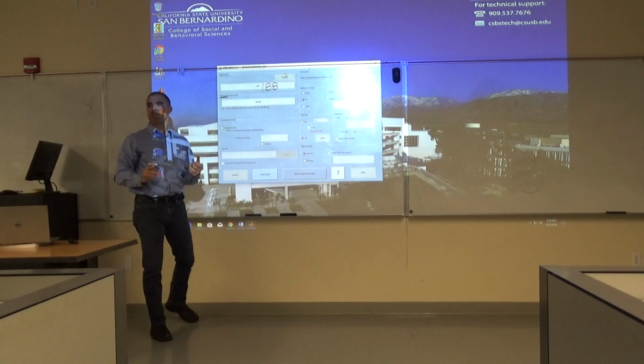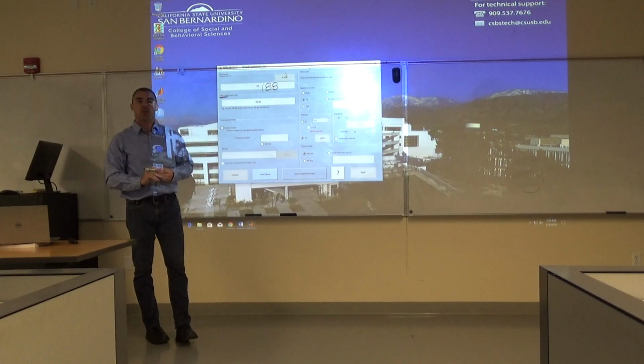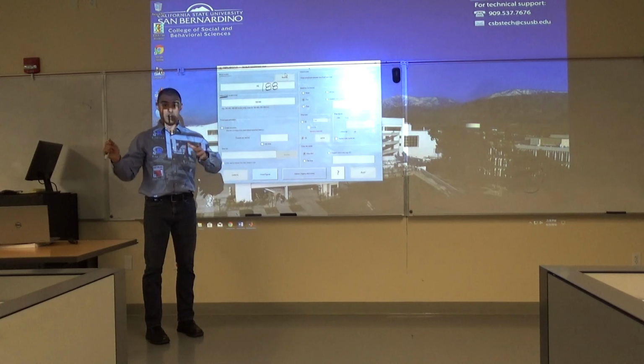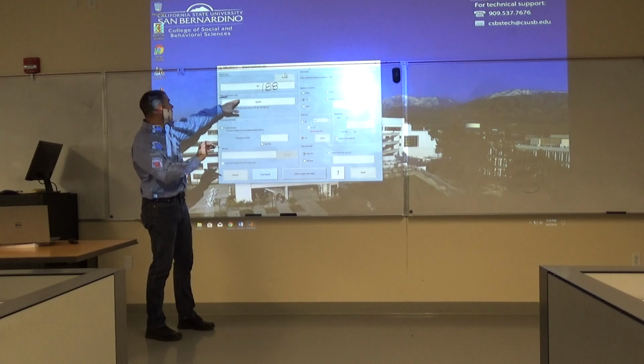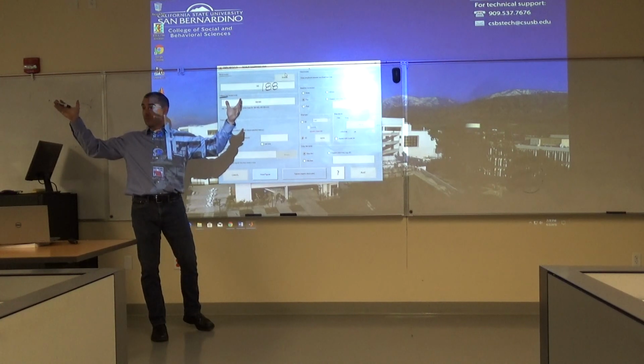Now it's also going to ask you latencies. So latencies are time. You are the queen of your castle. Gentlemen, you're the king, if you want to be. And so you want to see this pretty picture of brain data, right?